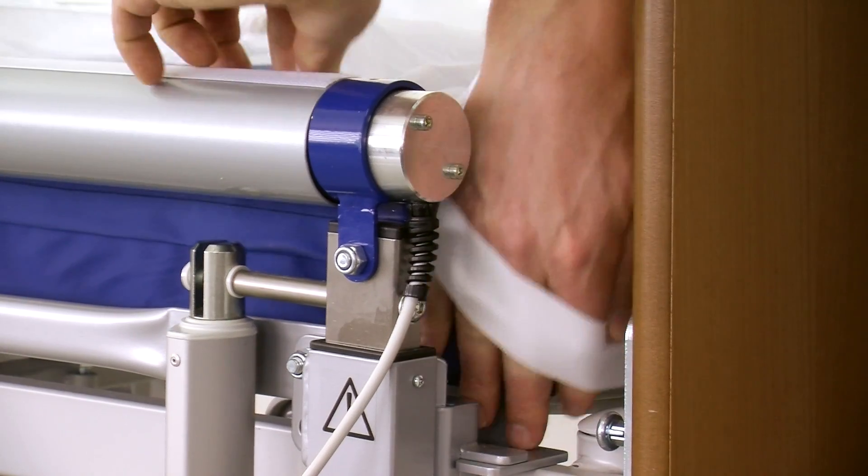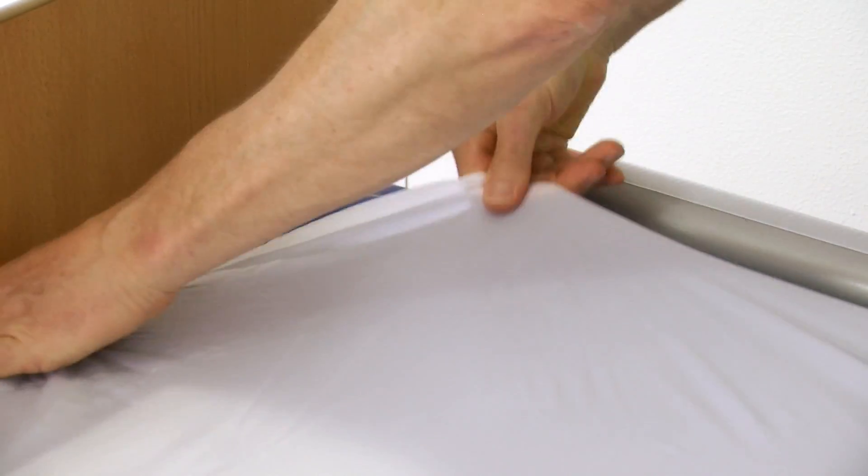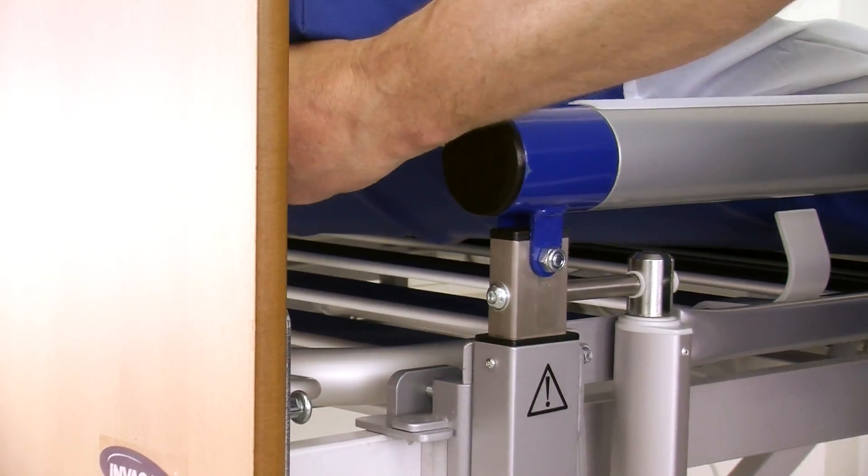Place the elastic bands from the corners of the slide sheet around the mattress. Check that the surface is smooth without creases or folds.